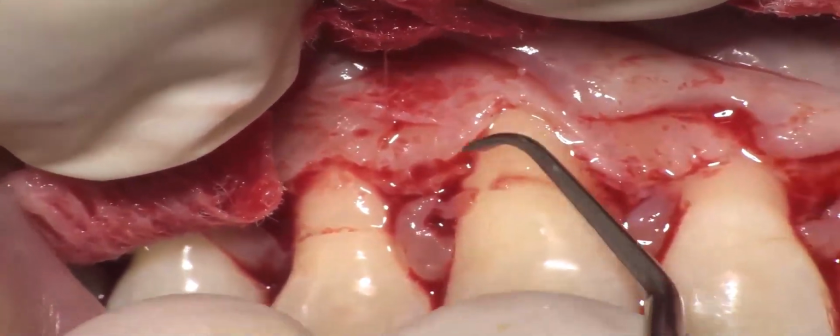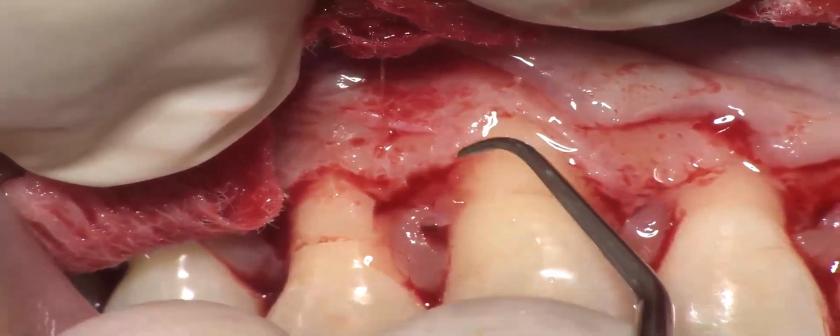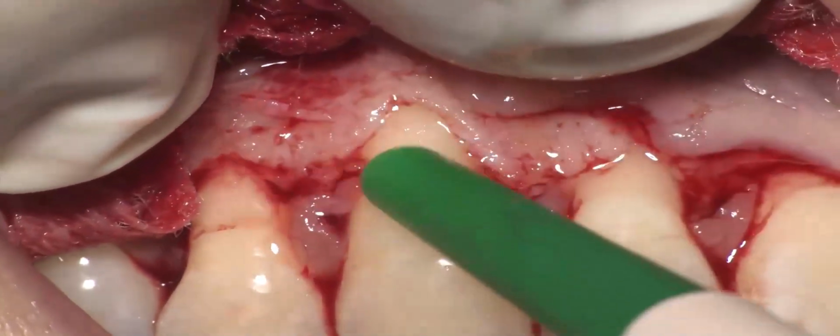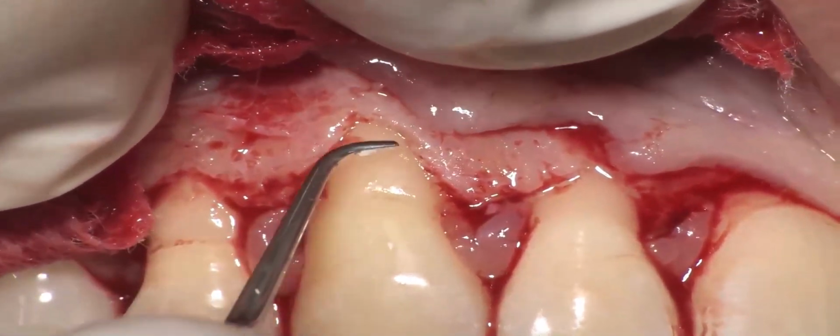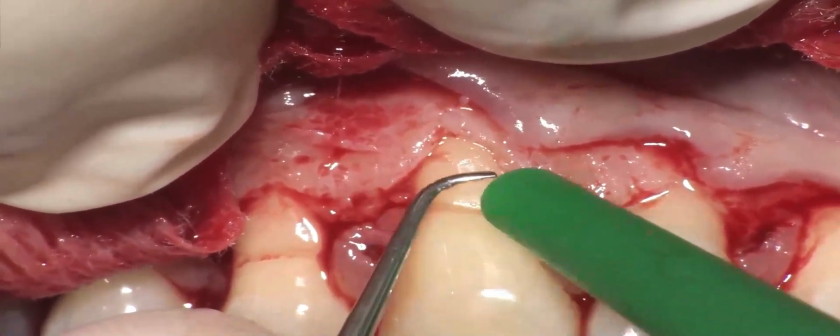Once half of the root is now hard and smooth, we turn the extremity of the curette and we are making root planing of the other half.